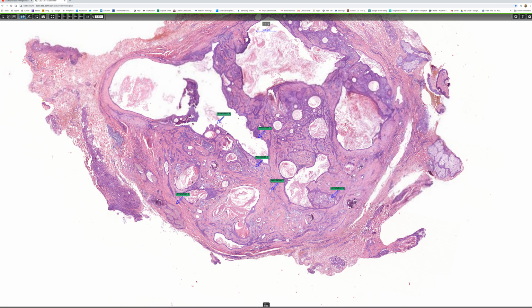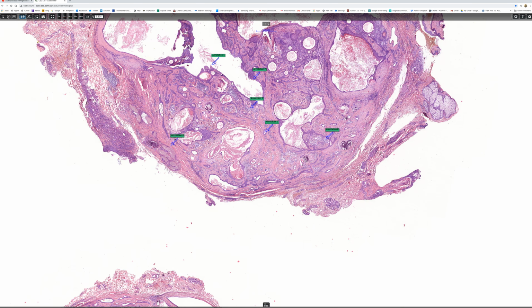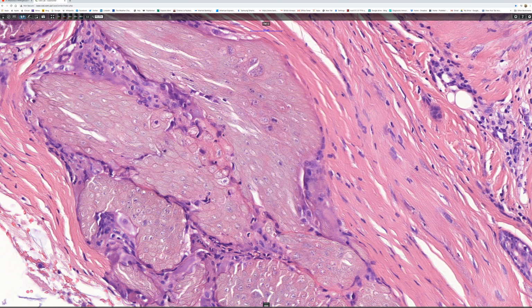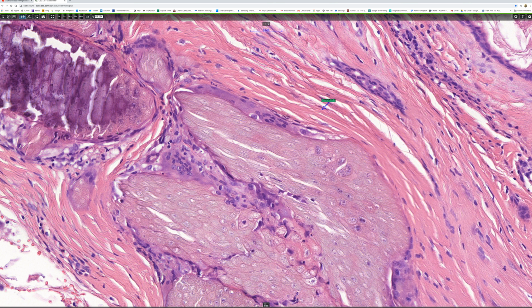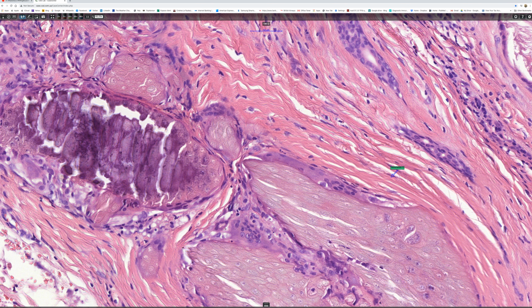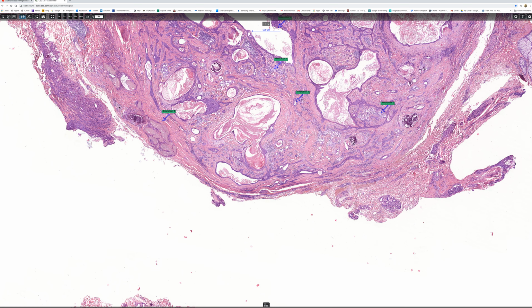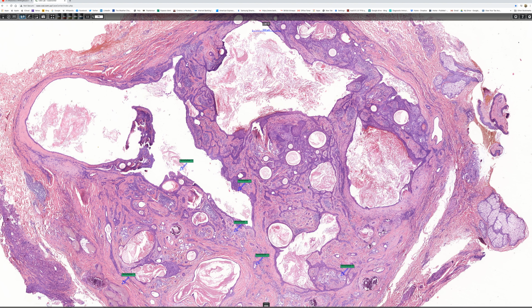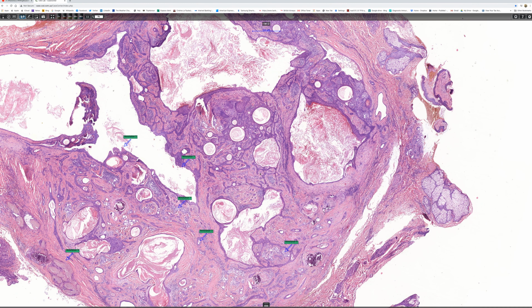But there's something that's really nice right at the edge here, which just shows that you can get follicular differentiation. I'm hoping that all of you will recognize this as a focus of ghost cells, very, very beautiful, which is something that you see in pilomatrixoma, which is a hair matrix tumor. So that confirms in this particular example that we do have evidence of follicular differentiation. When you get hair follicle differentiation in a mixed tumor, it can be anything from, as we've seen, the matrix all the way through to frank hair shaft formation and everything in between.